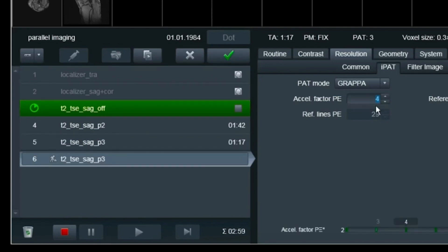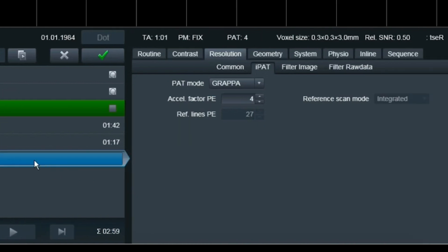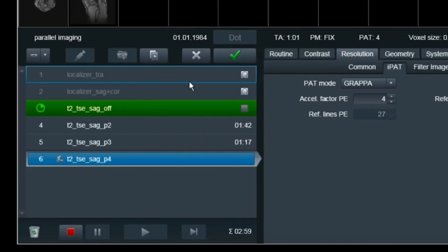Now let's go for PAT4. The relative SNR is now at 0.50. So starting from 1.0, with PAT4 I'm losing half the signal. The scan time is now around 1 minute. Let's see if my parameter settings can handle PAT4 and scan that one.